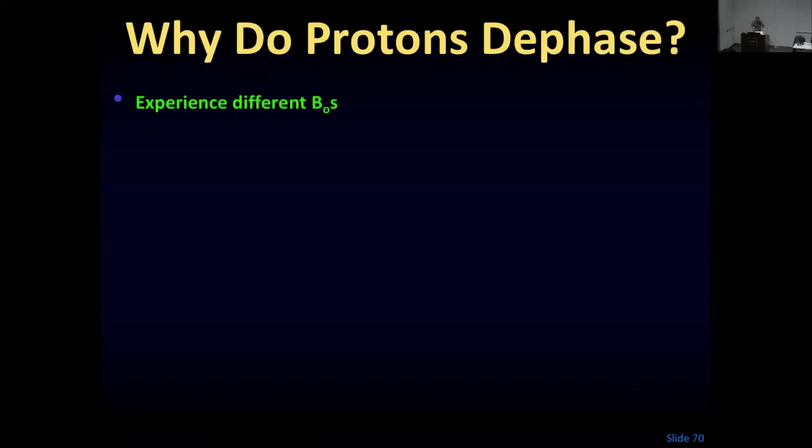Okay, now why do protons dephase? I mentioned that if the protons did not dephase, if they all stayed at exactly the same precession frequency, we'd have no dephasing, there'd be no signal loss. But protons dephase. Why do protons dephase?